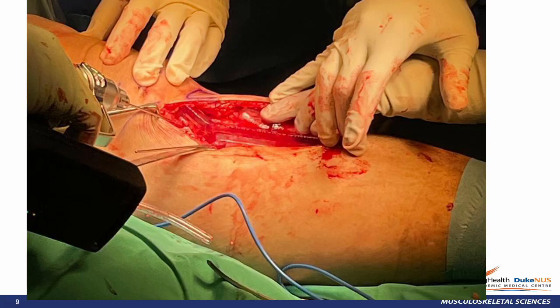After being put supine and under general anesthesia, a longitudinal incision of 20mm medial to the tibial crest and inferior to the joint line is performed. Soft tissue is carefully dissected and releases are performed to enable the jig to sit securely onto the tibia bone. 3 2mm K-wires are then inserted as planned on the jig.